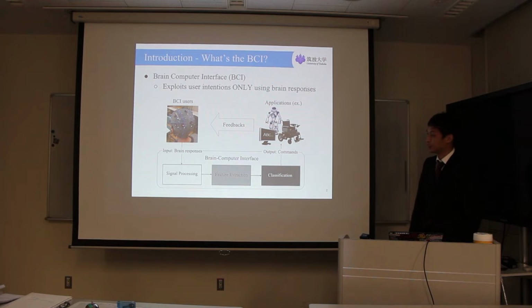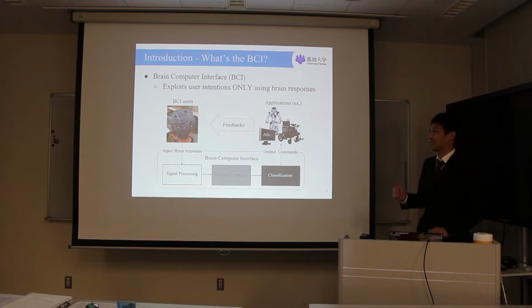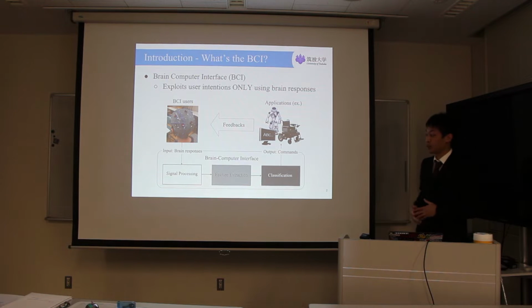So at first, let's begin with a brief introduction about BCI. BCI stands for the Brain-Computer Interface. This interface can exploit user intention using only human brain waves. So please look at this figure. These three diagrams show the main functions of the brain-computer interface.